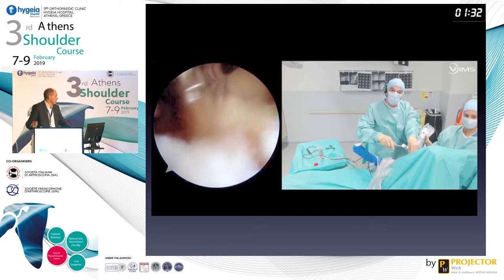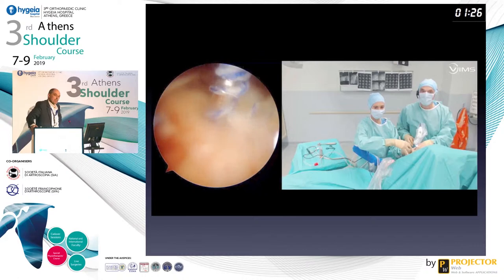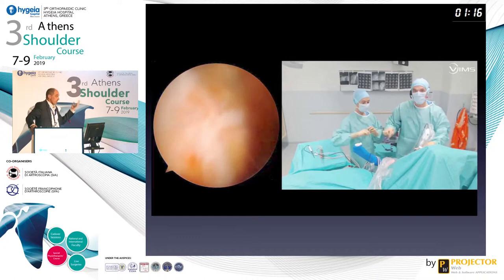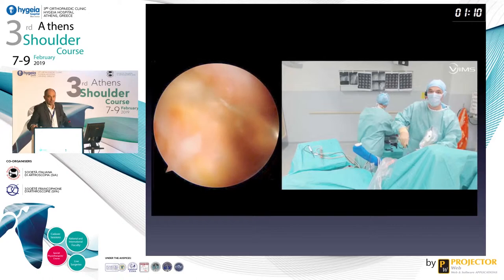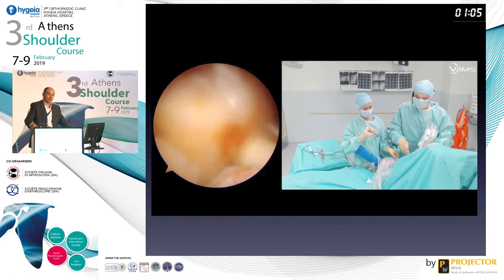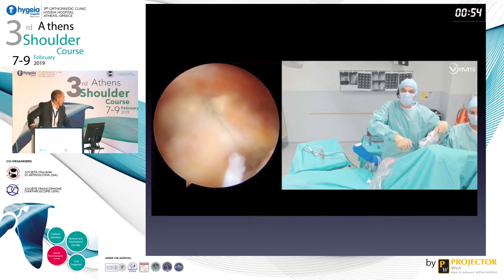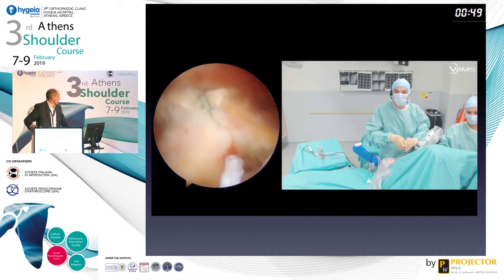So the blue suture is the upper part of the lat dorsi, which will be medial. This is my medial anchor close to the cartilage. I am exactly at the middle aspect of the footprint of the subscap. And my green suture will be the lateral one. Again, I want my transfer to be flat. And with a second anchor, I decided to make something easier now. As you pull, you can reach very easily the lateral part, and your tendon will be flat onto the footprint.